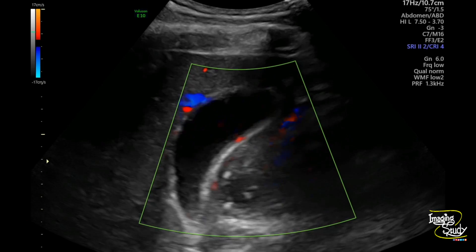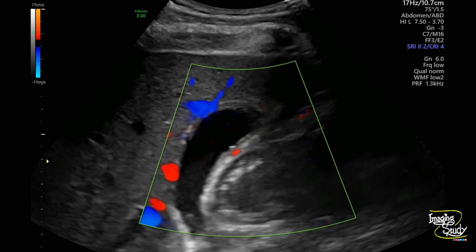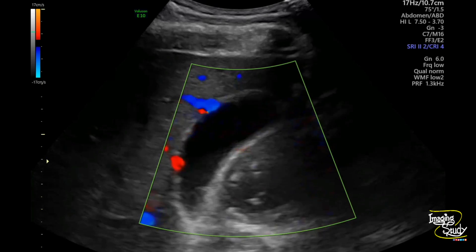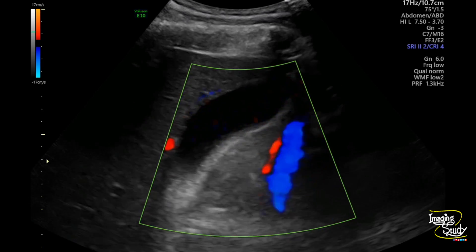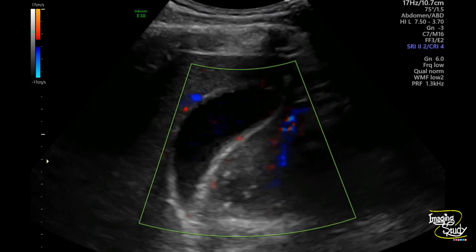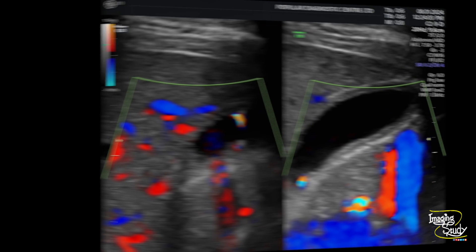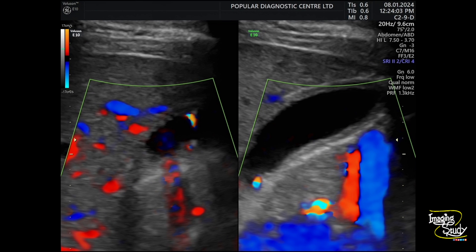Here we have used color Doppler. There is no abnormal vasculature seen around. Though from this video we can't see any twinkling artifact, here on this image I can show you these twinkling artifacts coming from those comet-tail artifact areas.